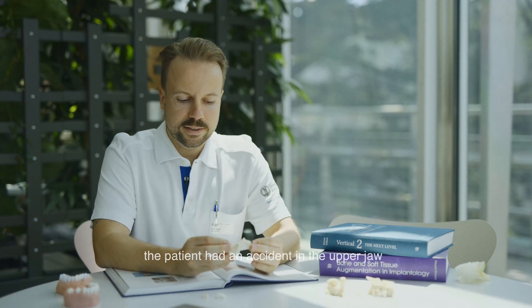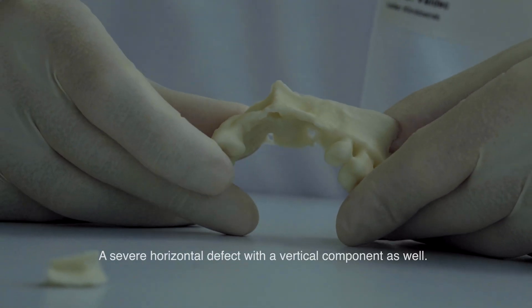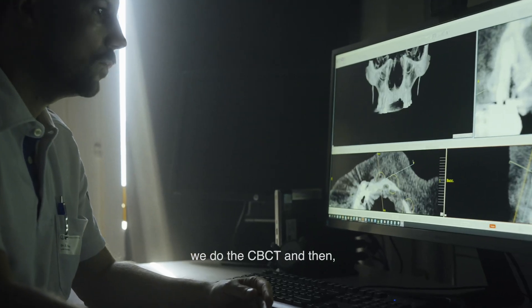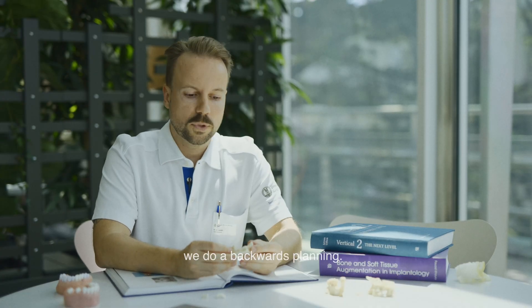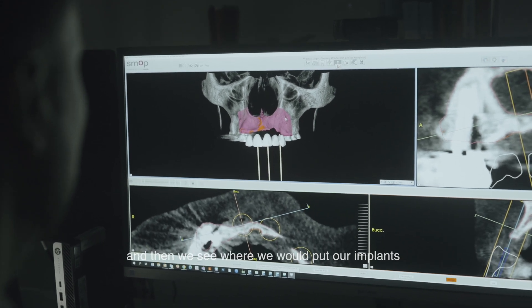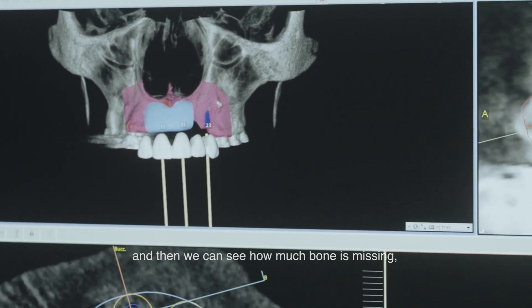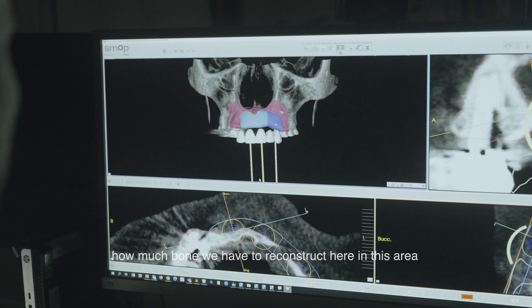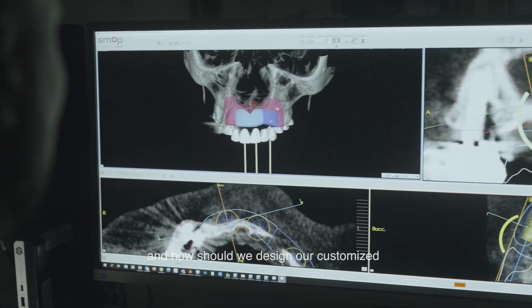This patient had an accident in the upper jaw with a severe bone defect — a severe horizontal defect with a vertical component as well. First we do a CBCT, and as always recommended in implant therapy, we do backwards planning. We insert a wax-up of the final prosthetic solution, identify the ideal implant positions, assess how much bone is missing, and design the customized allograft bone blocks for this patient.